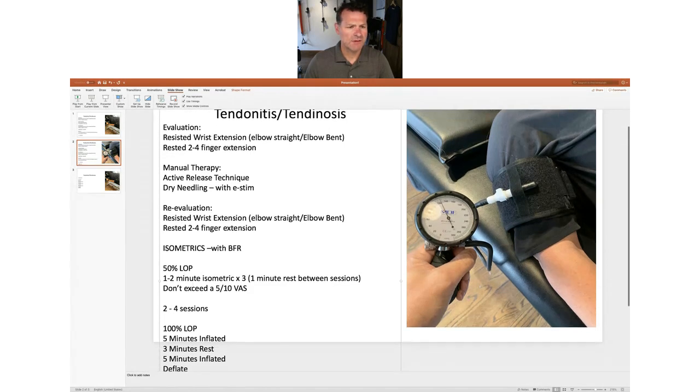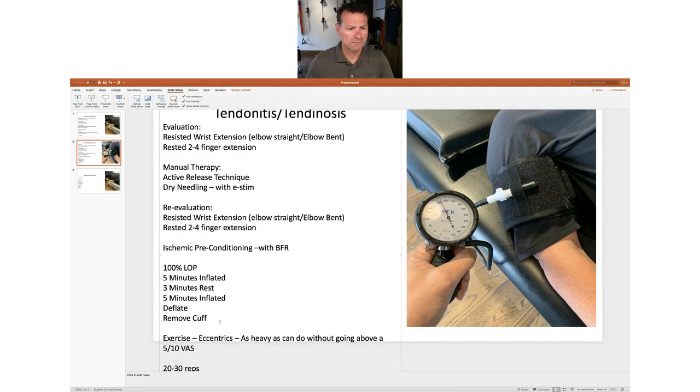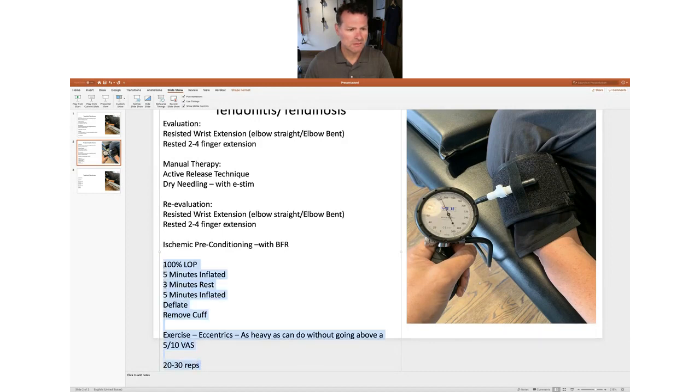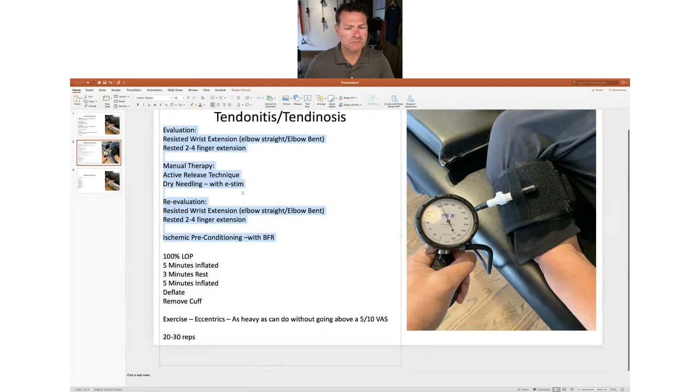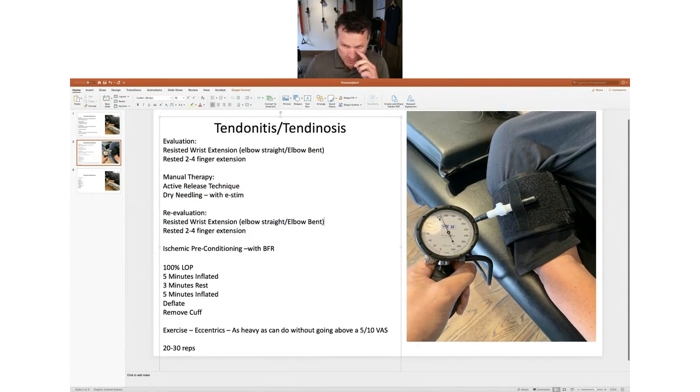Still my same evaluation. But now I'm going to do ischemic preconditioning. Okay, so this is going to be 100%. So there's that. Okay, so you can see here, she's at 124. That's her 100% limb occlusion pressure. I've got that inflated. She's going to go 5 minutes on inflation, 3 minute rest, 5 minutes inflated. And I'm going to deflate, remove the cuff, and go right to the exercises.